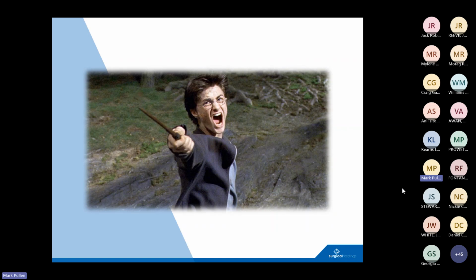So if you were to hold a scope at the distal tip, which is what I've seen, pass it to someone, wave it around, the weight of the body of the scope could potentially crack a rod lens and damage the internals in that system. So we just say always hold the scope by the body, not by the shaft.